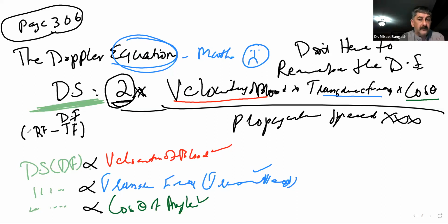Where you can get a positive value or a negative value. The positive and negative value is a factor here, because we mainly said that velocity was just speed in direction. So the direction is important here. But how is it that the system is able to determine the direction? It is with the help of this.